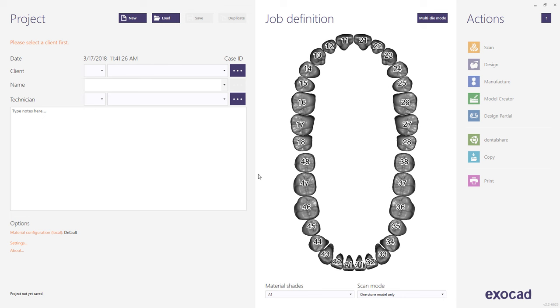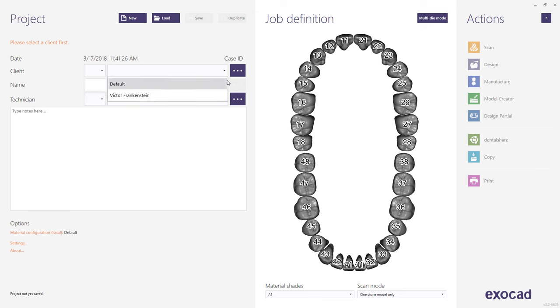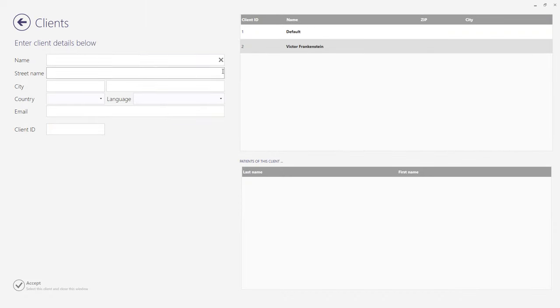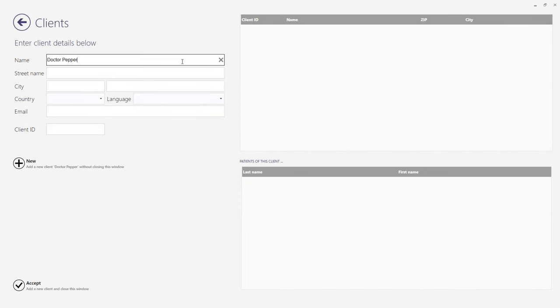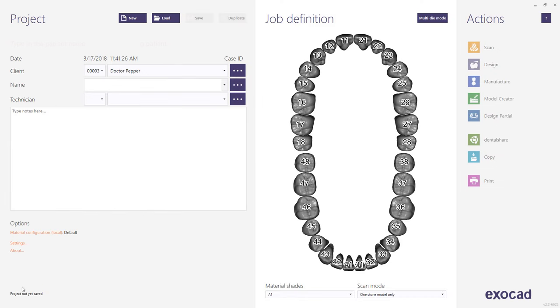Start by running the DentalDB application. Select a client from the drop-down menu or add a new one by clicking on the three dots. Enter the patient name or case number. A technician may be entered as well, but it is not mandatory.